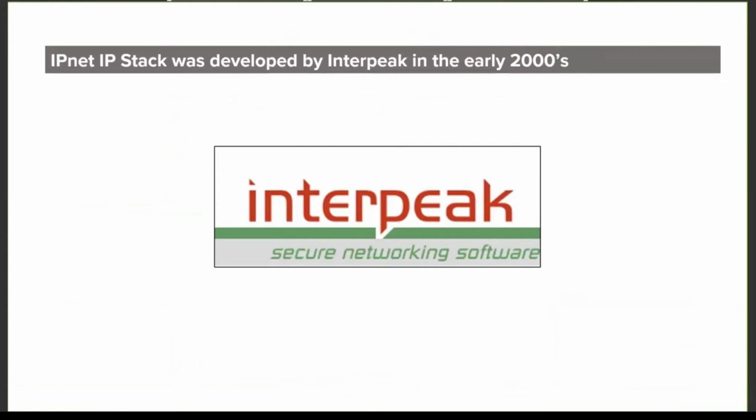Okay, so that's a really cool story, but let's try to understand what happened here. Once we managed to crash the Alaris device on the DEF CON show floor, we started to look into what exactly happened here and how it is possible that the device maker didn't even know that his device is vulnerable. So basically, the IPNet stack was originally developed by Interpeak, a Swedish company, in the early 2000s.